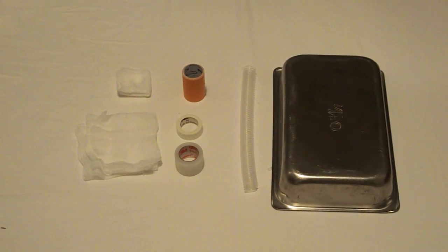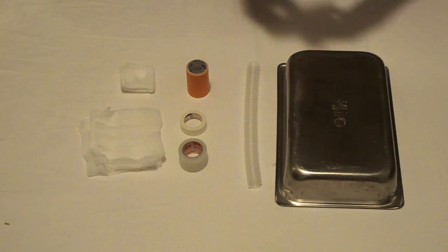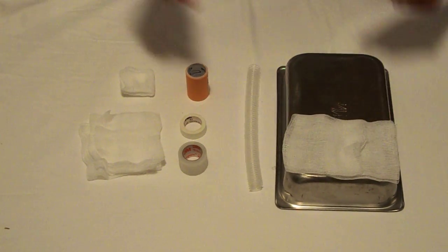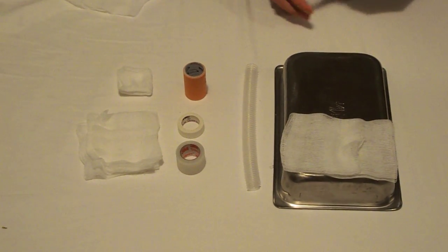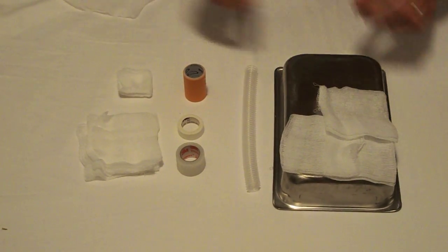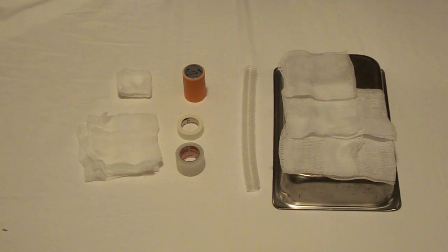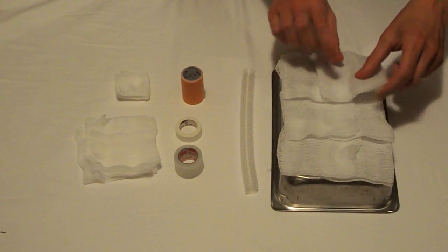So the first step is to place some of the 4x4 gauzes on the base. This is to help secure the trachea and to prevent it from rolling around. If you have a base that has a lot of friction on it or is really rough, you might not need these 4x4s at all.